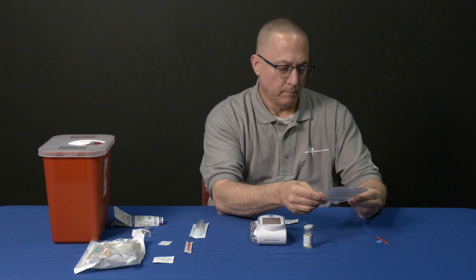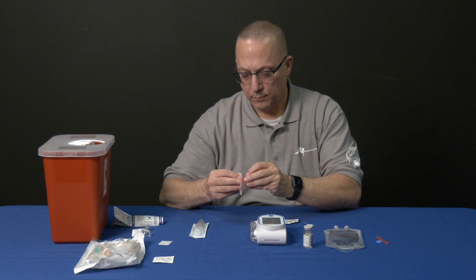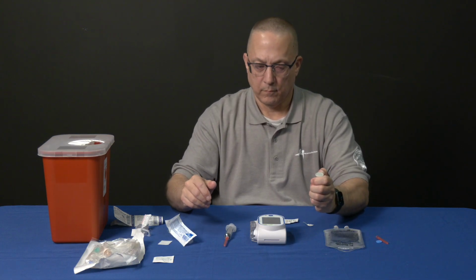Calcium chloride. Assemble a new blunt fill needle and 10 milliliter syringe. Remove the cap from the medication vial. Clean the rubber top with a new alcohol prep.